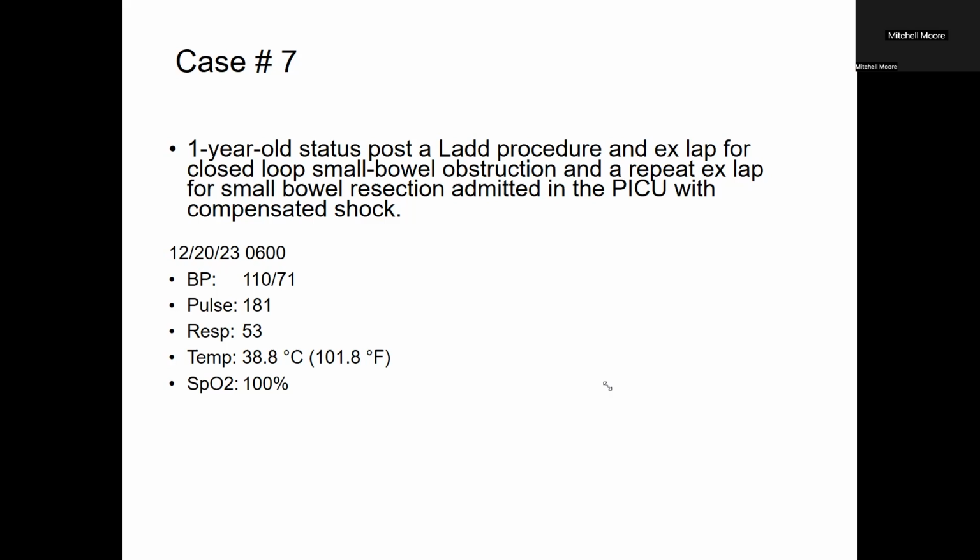So how do you position your probe in a way that you won't see lung parenchyma if, clinically or on chest X-ray, you see a pneumothorax, but on ultrasound you may see A lines that would be consistent with lung parenchyma? Do you understand my question?